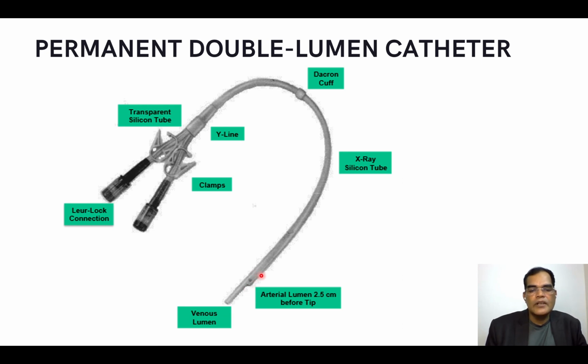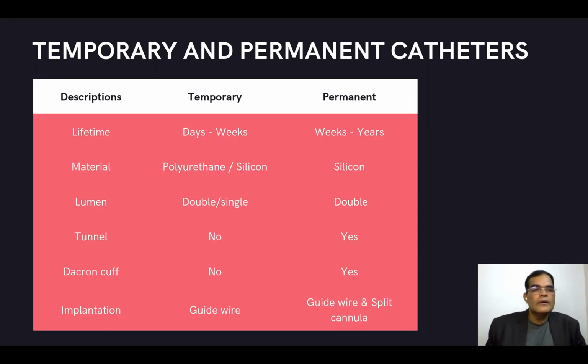This will be the arterial lumen, and this is the venous lumen, through which blood goes back to the patient, and through the arterial lumen blood will be sucked into the system for the dialysis extracorporeal sets, and after that it will be delivered through the venous cannula, and the lumen will be over here. So this can be given in a little more detail in the coming slides.